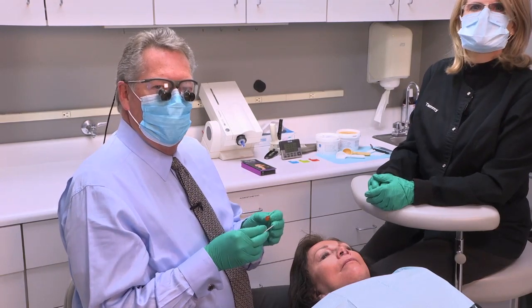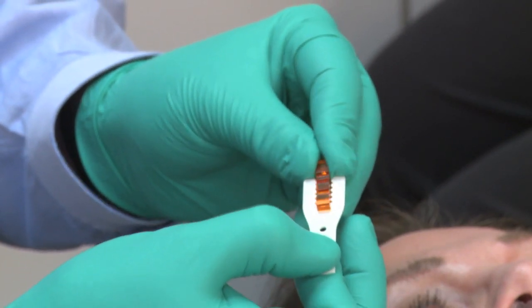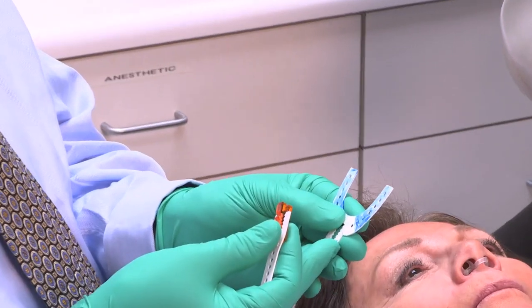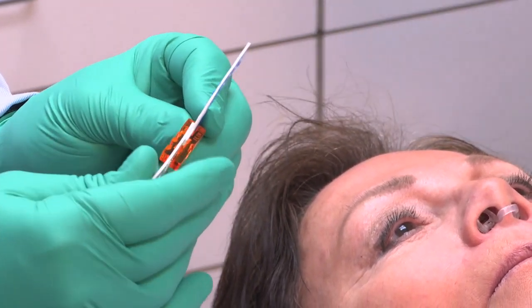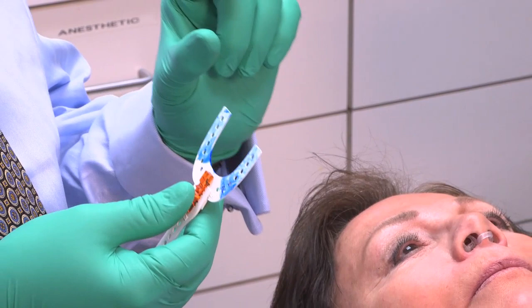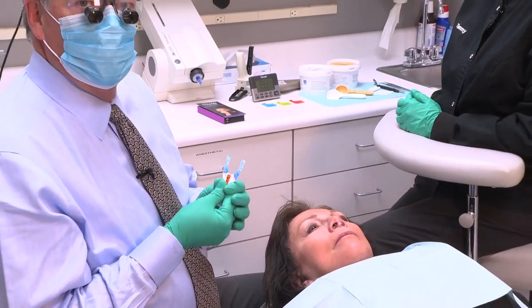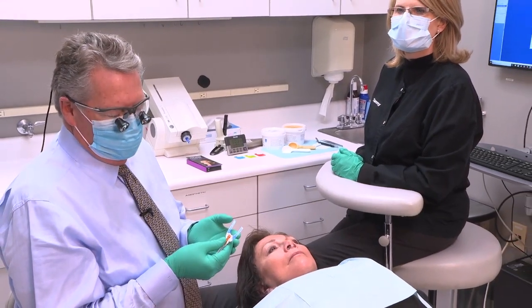So in this situation, it doesn't matter where the handle goes because edge to edge is edge to edge. So we're going to put the handle on the front part in that little slot. And then Tammy has painted the bite fork with some of the Panasil adhesive so that the putty is going to adhere to the bite fork. The reason I like putty is because it doesn't slump. Since we have a vertical component, I would like to have a nice thick bite registration. So my choice is the Panasil putty. We use all Kettenbach products in our practice for all impression materials. So we're going to show you today how we register the bite using the Panasil putty.